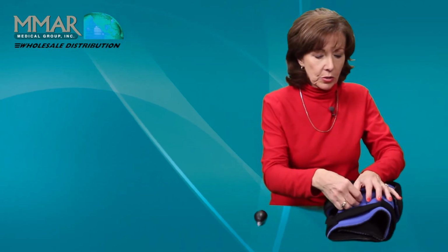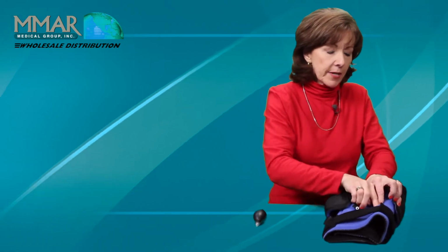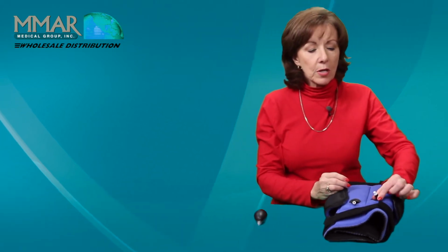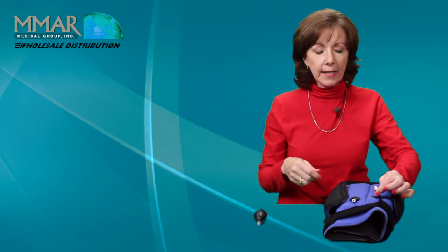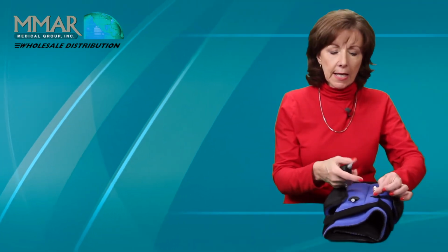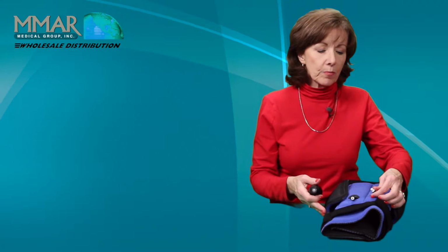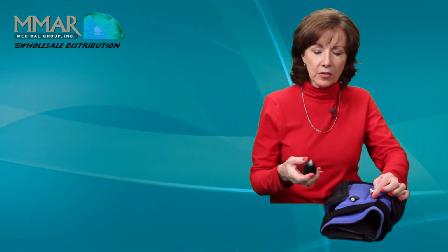Now we're going to inflate the air bladders. Pull out the tip. And we want to hold the end of the tip secure that's in the black. If not, we run the risk of this loosening, and if you break that seal, it may leak, and we're happy to replace those, but you'll have very, very good luck with them if you just follow these instructions.